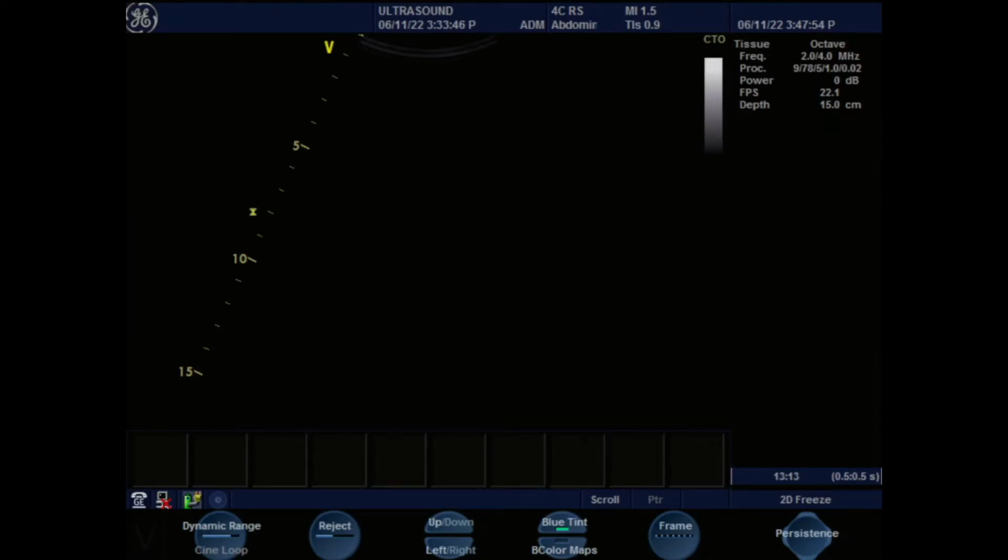Oh, okay. So patient positioning makes a lot of difference. It helps ease the image acquisition. So for a right upper quadrant, I would have you, of course, pull your shirt up, please, and straighten your legs out. And then your shirt pulled up.